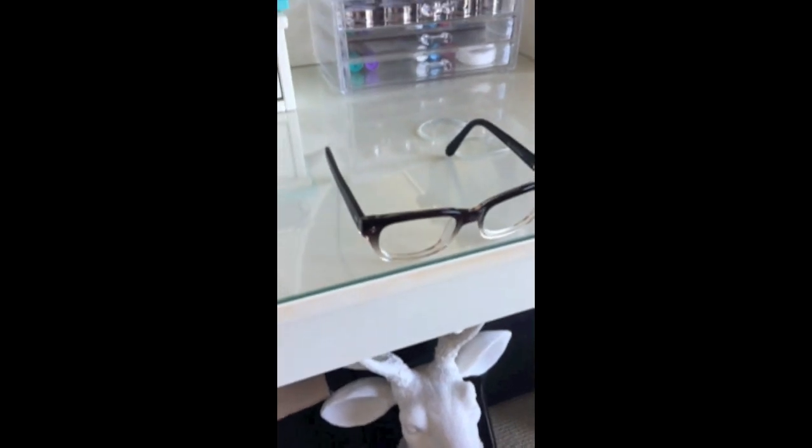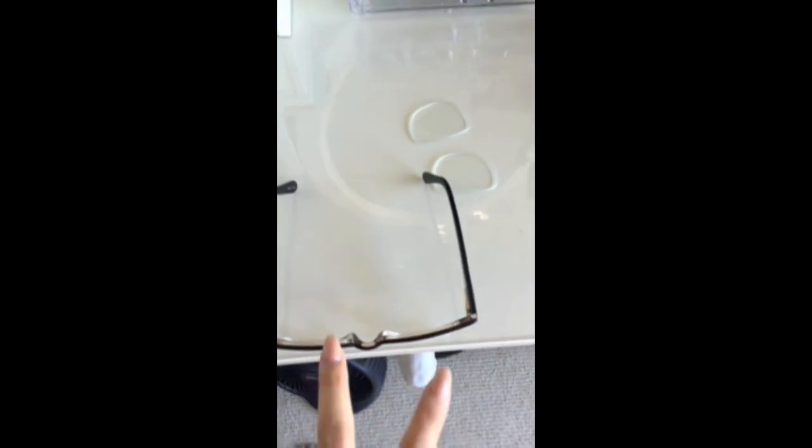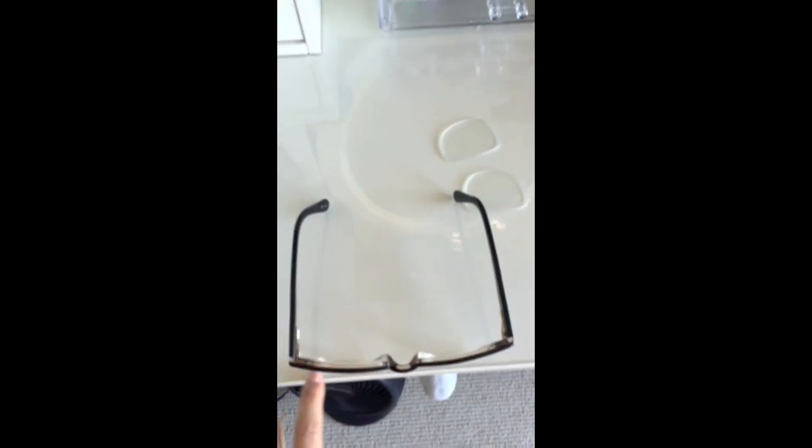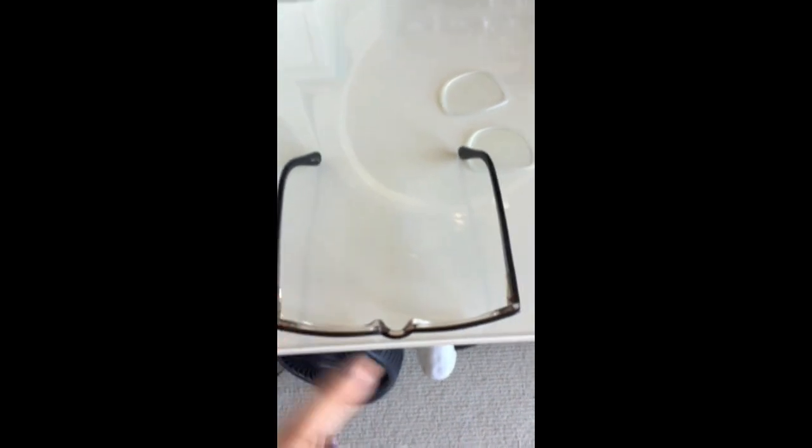And you don't want to adjust any frame that's crooked from the bridge. I'll show you an example of what I mean by that. The first thing you want to do is make sure that the eyeglasses isn't crooked at the bridge — you want to make sure that it's not twisted in any way. Place your eyeglass along a straight line and view it from the top to see that both lenses are straight along the line. That indicates that it's not twisted at the bridge.